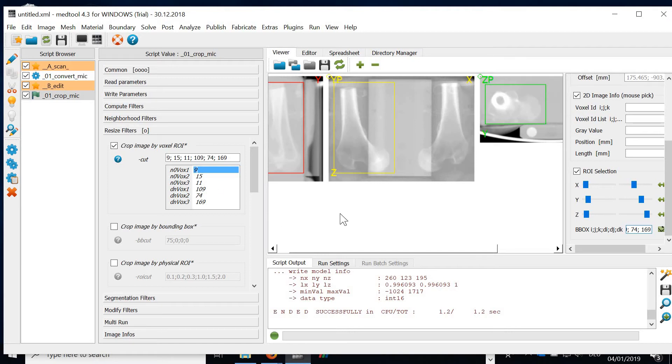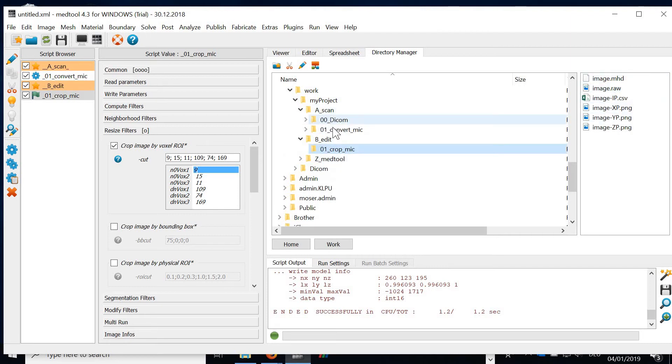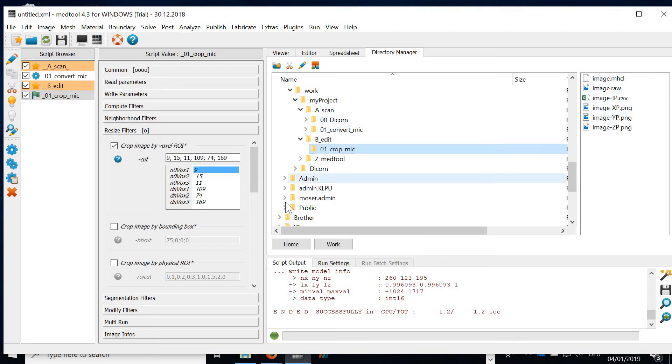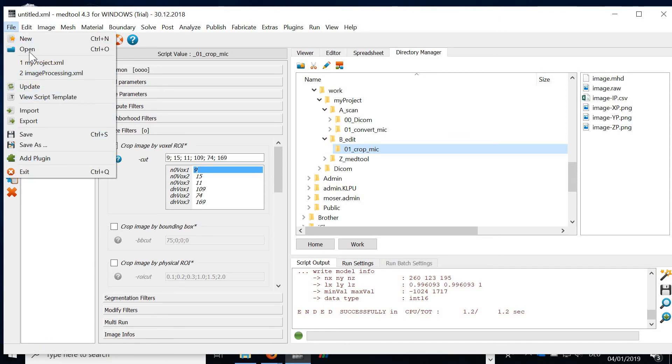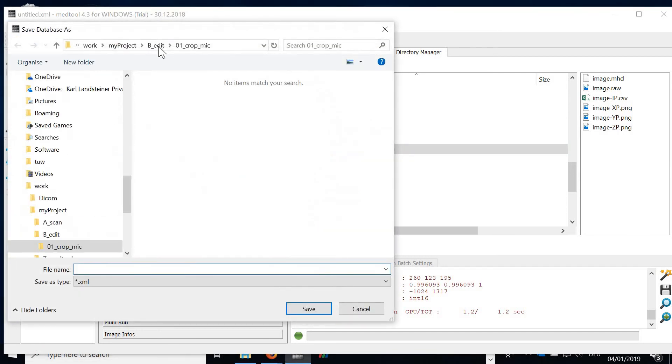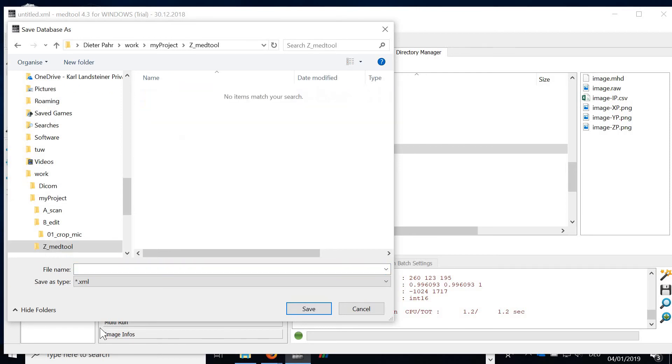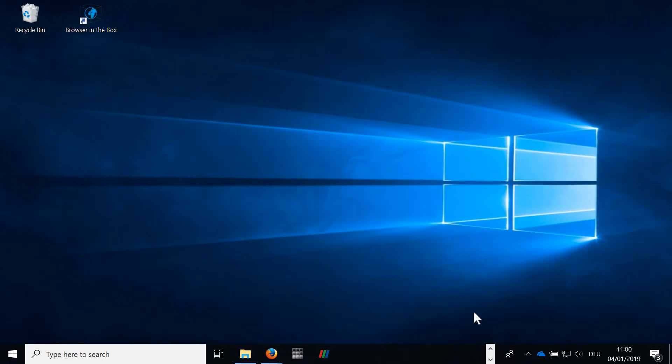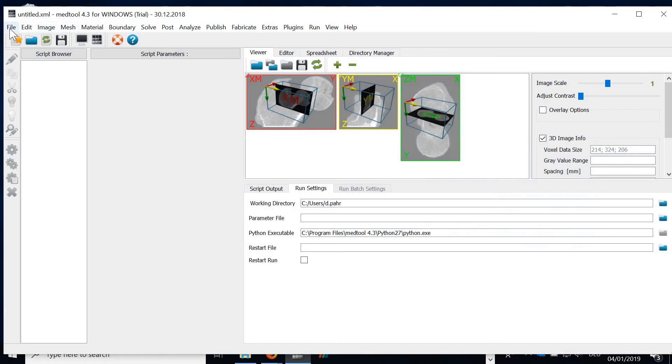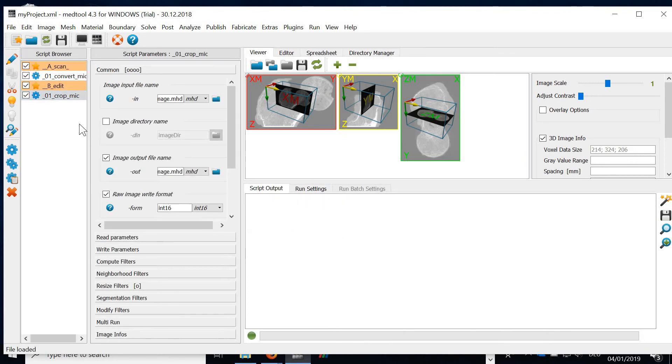Now finally what we'd like to do is save our database. So therefore we simply click here on save. And now we see why we need this in this project folder, the Medtool database. So I would save this here under the same name. I call it my project. The format is XML. You can close Medtool, and if you reopen Medtool after some time, you see here there's a folder which is called my project. You open it and you have exactly the same status. And you can start running the script.